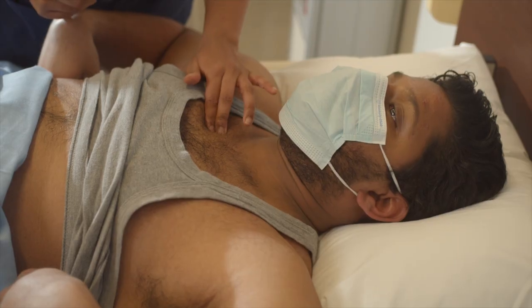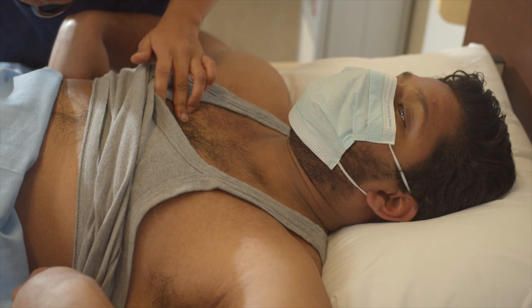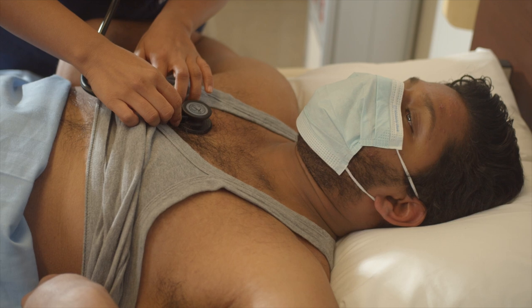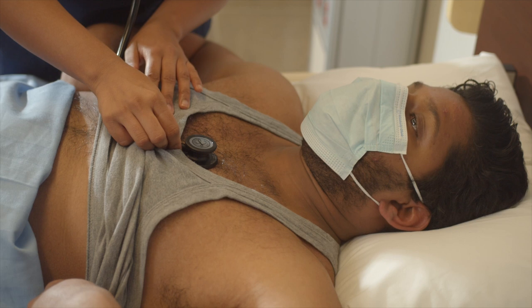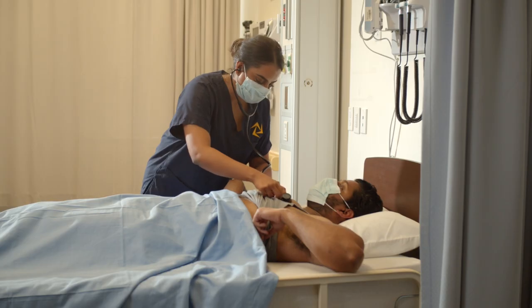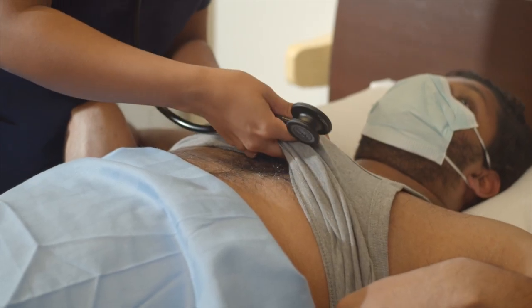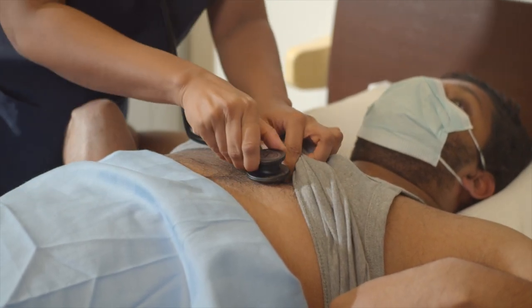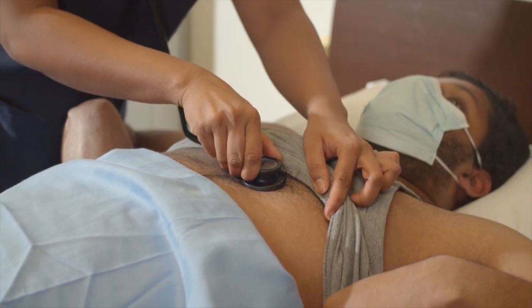I'm going to landmark. I'm going to listen to your aortic valve first. I'm going to listen to your pulmonic valve next. I'm now going to landmark lower down your chest. I'm going to place my stethoscope over your tricuspid valve and I'm just going to move over to your mitral valve.